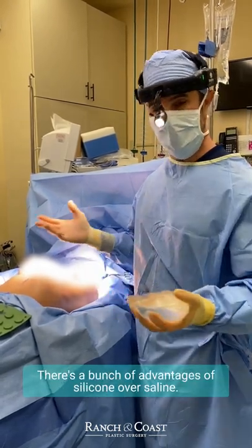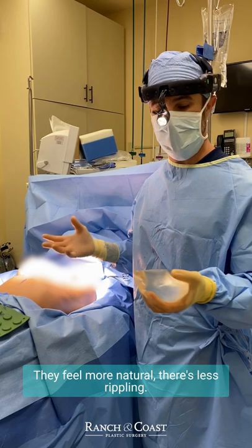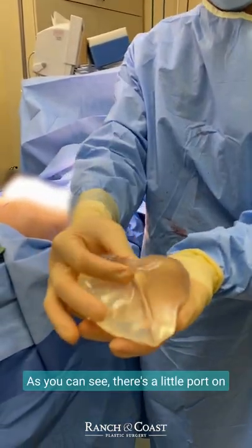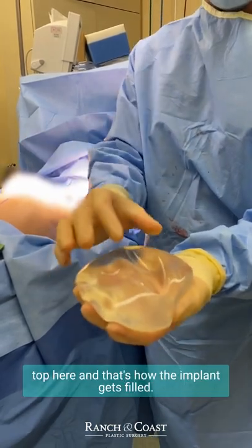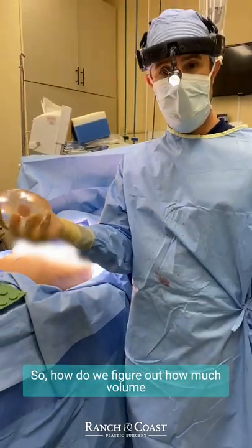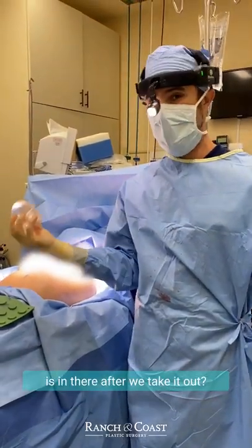There's a bunch of advantages of silicone over saline — they feel more natural and there's less rippling. Here's the saline implant we just took out. As you can see, there's a little port on top, and that's how the implant gets filled. You can take a saline implant and fill it to different amounts. So how do we figure out how much volume is in there after we take it out?